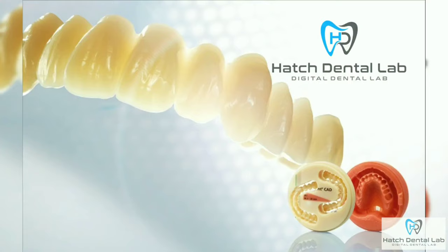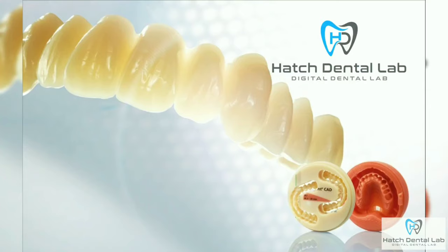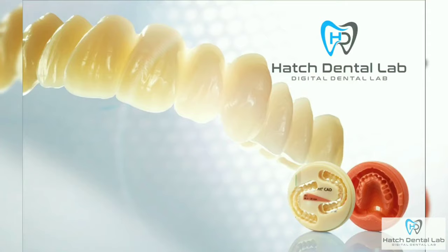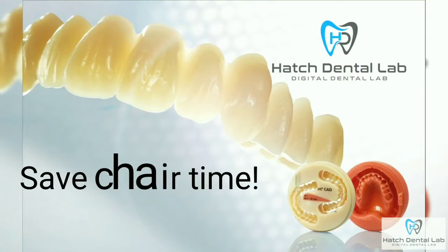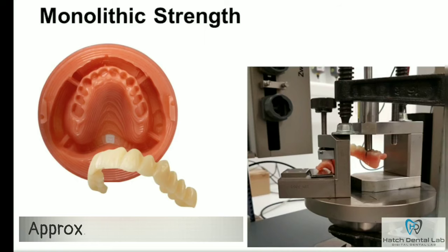A few benefits right off the bat before we show you the process are: one, the fit is better with more attention and less sore spots. Two, we'll keep an electronic record of the case for quick and easy remakes if the patient loses or breaks their denture. Three, the process to make a denture is faster, saving the doctor and patient chair time. And four, our milled dentures are approximately eight times stronger than traditional analog dentures.